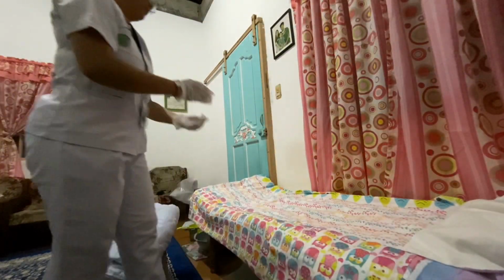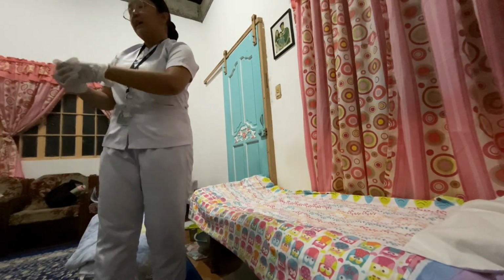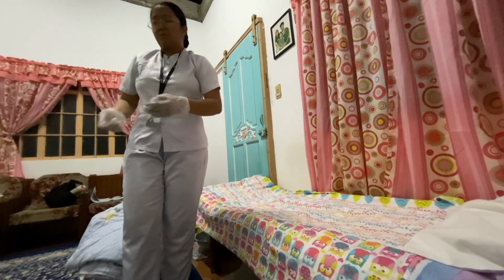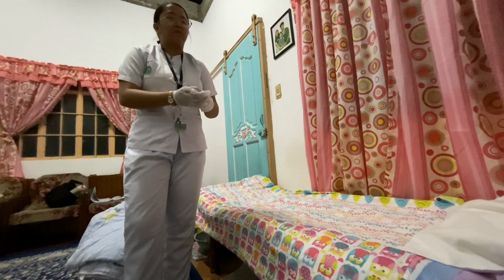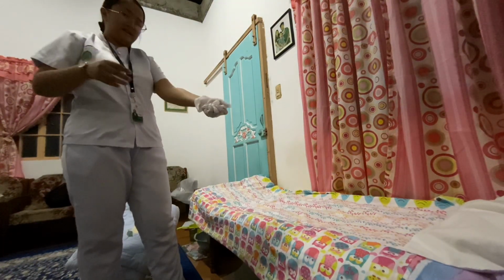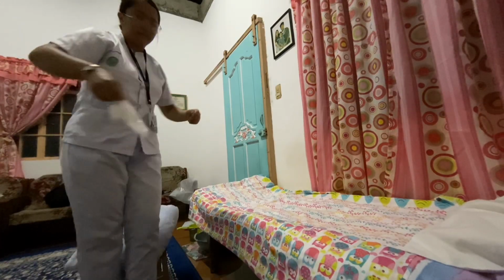After that, I'm going to secure the signal device on the bed, raise the side rail, and lower the bed. This promotes safety and comfort to the client. I will also dispose of the soiled linen to prevent the spread of microorganisms. And now, I'm going to remove my gloves. Yan. Then out. Then sa container.